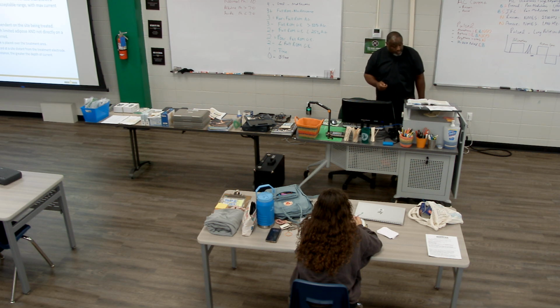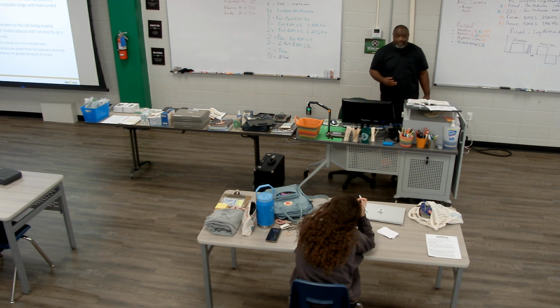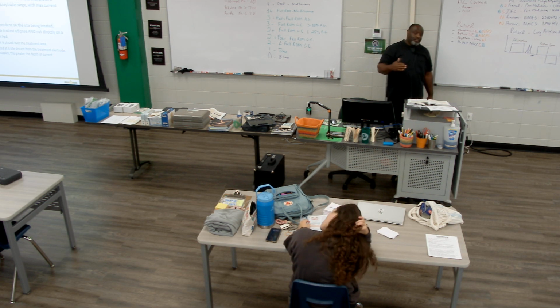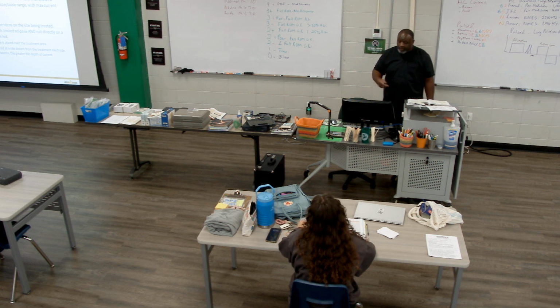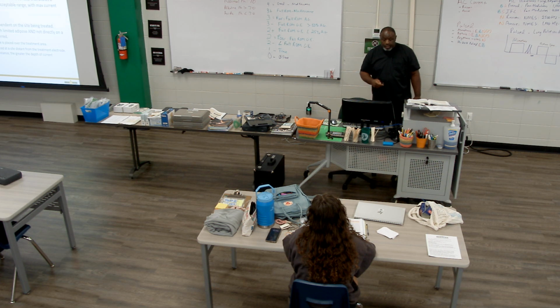Most of the electrodes can handle a dosage current up to about 4 to 5 milliamps, which is good because the highest you're going to get on an actual DC device is like 3. Some devices will offer 4, but I've never seen an iontophoresis device that offers an amplitude of 5 or greater. So the electrodes are designed to handle the current. And again, active is in the treatment area, inactive is at a distal site.